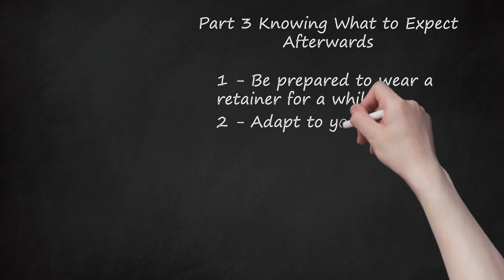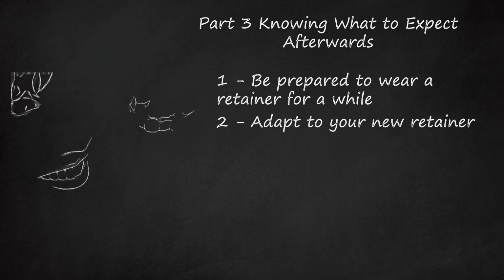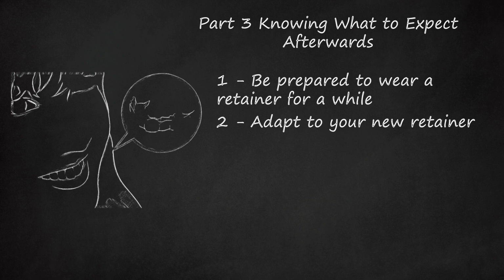2. Adapt to your new retainer. Getting a retainer can be a little trying and take a bit of time to get used to, but it's an important part of straightening your teeth. The retainer might feel awkward in your mouth, and you may find it hard to speak, or discover that you are speaking with a lisp. The best way to deal with this is to speak and sing a lot so that you get used to the retainer. Do this, and your lisp should disappear in a few days.